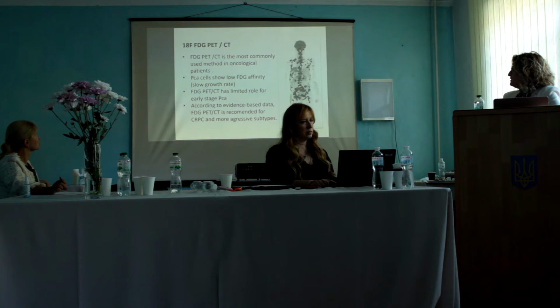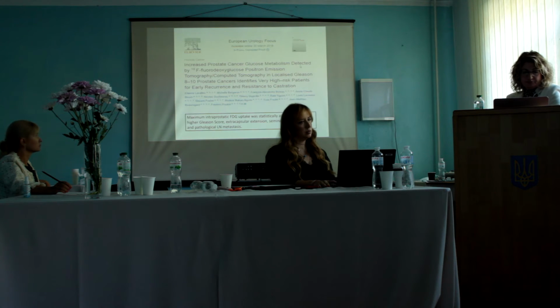Another radiopharmaceutical we know, and apply in many different cancer types, is fluorine-18 labeled FDG PET scan. FDG PET is the most commonly used method in oncological patients. But prostate cancer cells show low FDG affinity related to slow growth rate. FDG PET-CT has a limited role for early stage prostate cancer, but an important role in castration-resistant prostate cancer and more aggressive subtypes of prostate cancer.